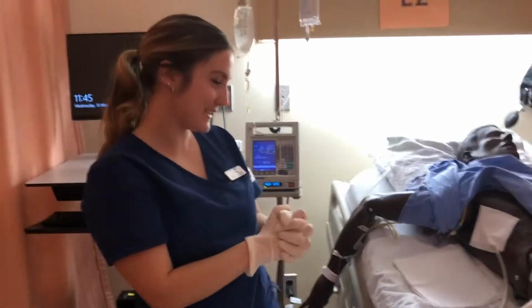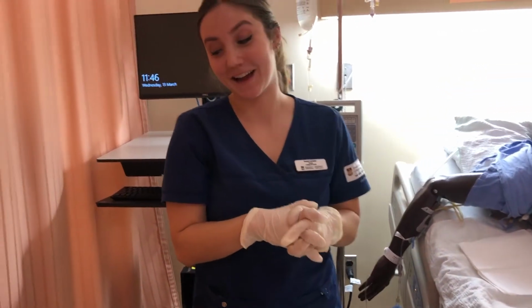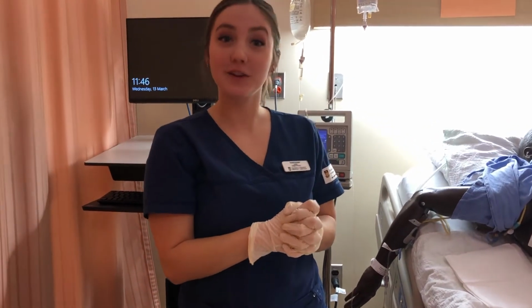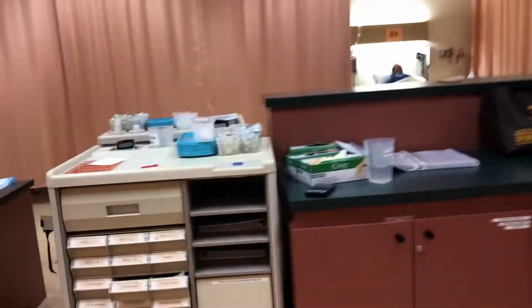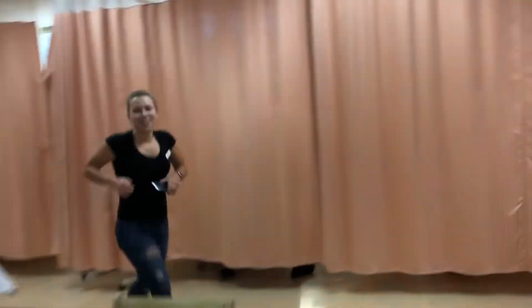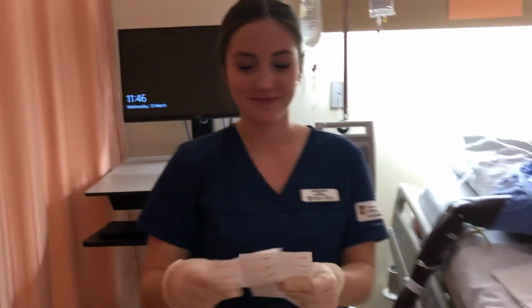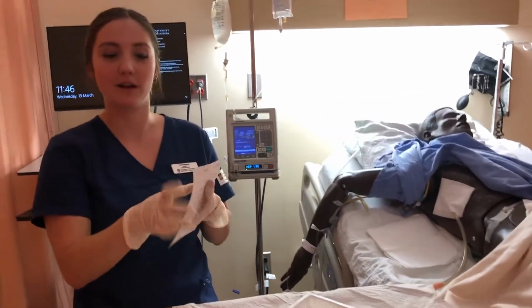And I would be putting cloth tapes over it. I would hand sanitize, and I would ask a second nurse to go get me some cloth tape, and she can go do that now. Thanks. No problem, buddy nurse. So I will make sure I put my date and time on here first because I don't want to write on my patient.